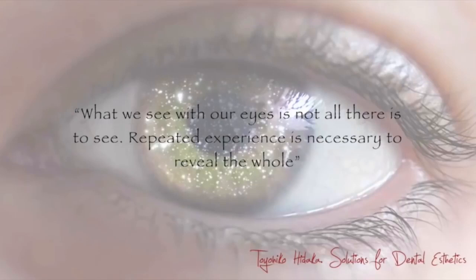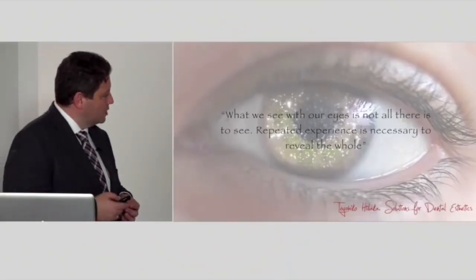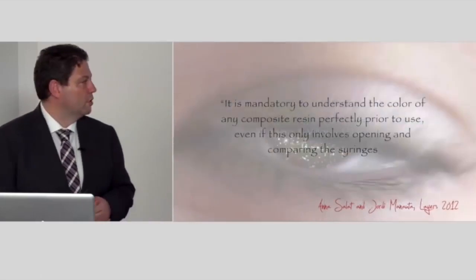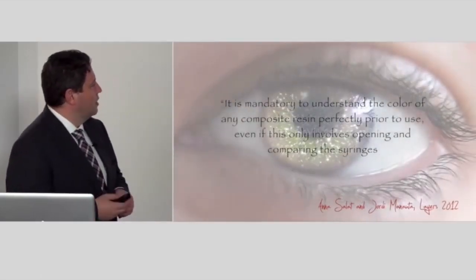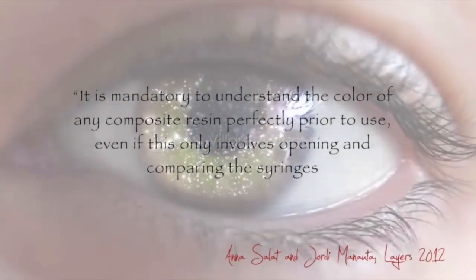So the most important thing is to know what we are doing, to see what we are doing, and train our eyes to see and to be more critical with our restorations. The other sentence I like to mention is one from the book by my friends Anna Salat and Jordi Manauta from the group Style Italiano, of which I'm a member: it is mandatory to understand the color of any composite resin prior to using it, even if it only involves opening the different syringes and comparing the color. That means you need to know the material you're using prior to using it in the mouth.